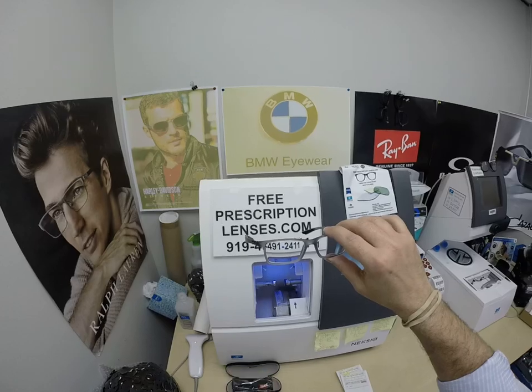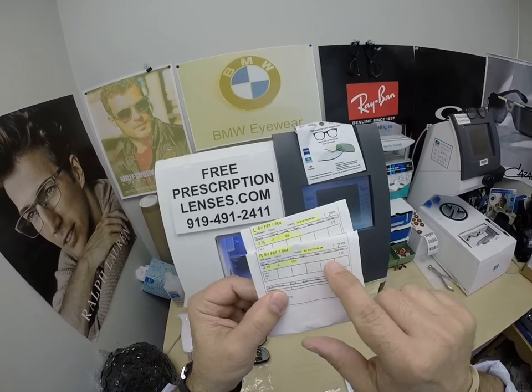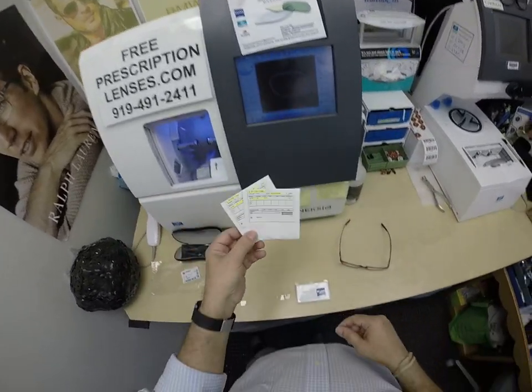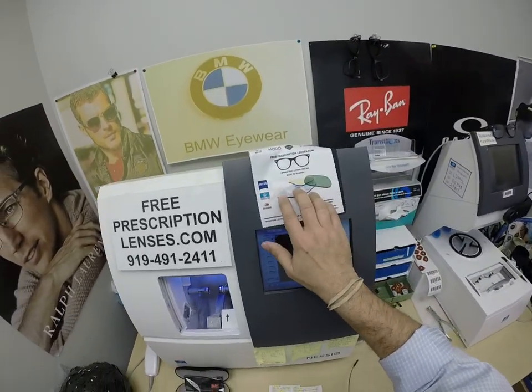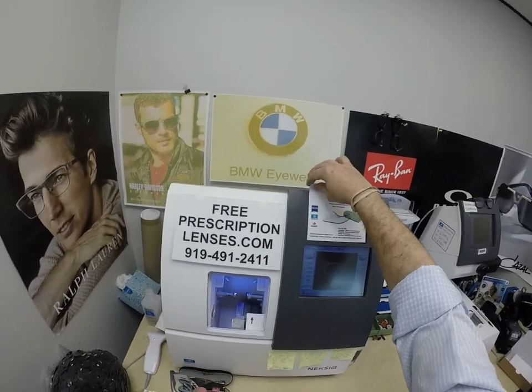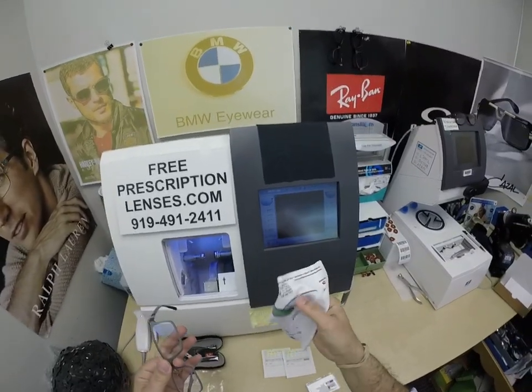He got his 1.67 High Index Photofusion Extra Gray with DuraVision Platinum, the premium anti-glare coating. I've highlighted the prescription for the right eye, same for the left. He's going to get all the packaging from Zeiss as they ship it to me — the Zeiss cleaning cloth. Of course you've seen the Ray-Ban cleaning cloth, but you get one of my premium microfiber ones as well, with instructions on how to care for your frame, lenses, cleaning cloths, and case, so those will last you for years.